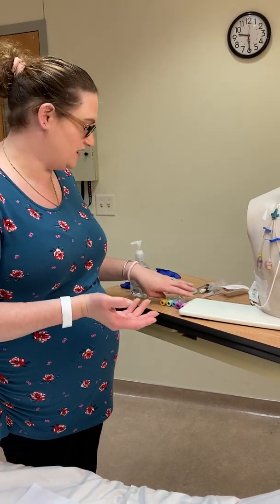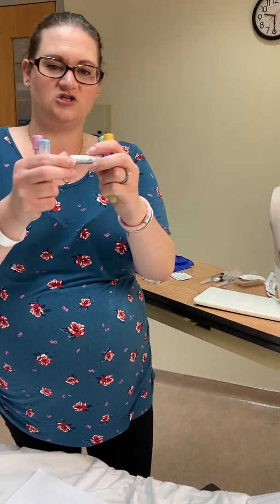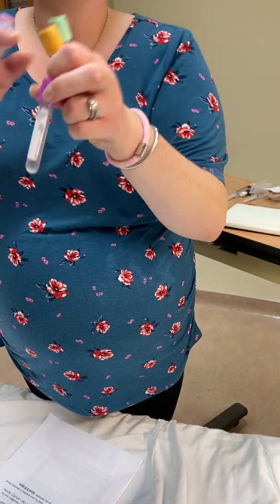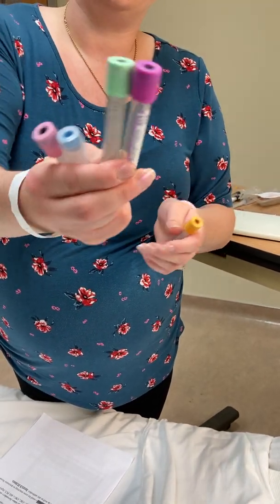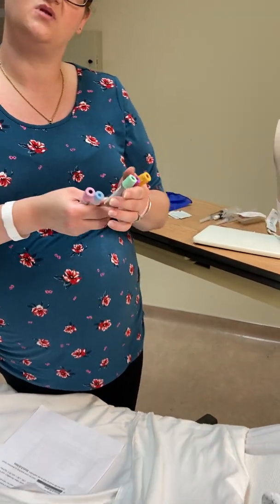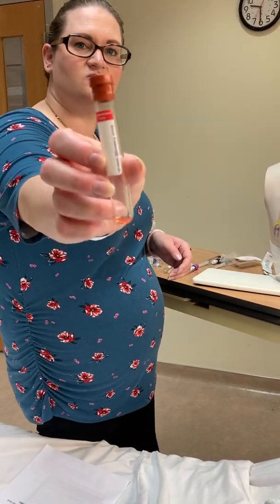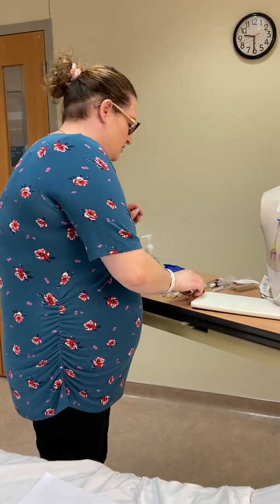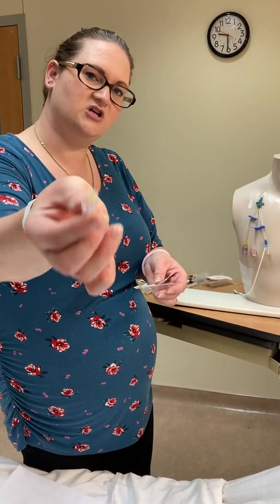We need to have an order, which will also help us determine which tubes we need to draw. There are many different colors of tubes and each tube tells you how much blood you need. For example, the lavender one requires 4 mls, the light green requires 3 mls. So drawing both would mean a total of 7 mls. The red tube is 10 mls, so you'd need 10 mls to fill that one.